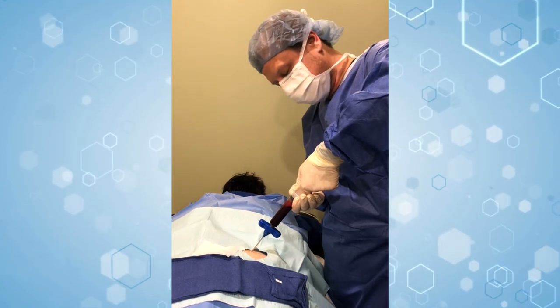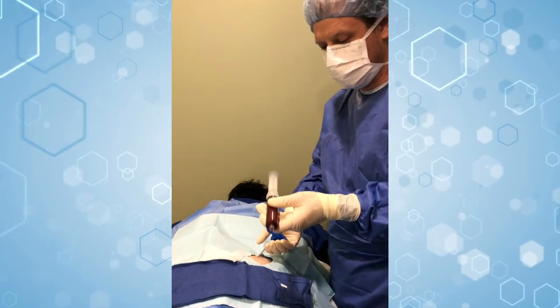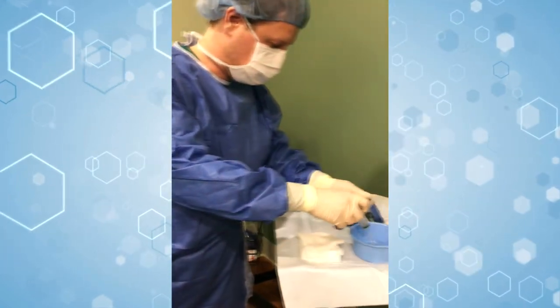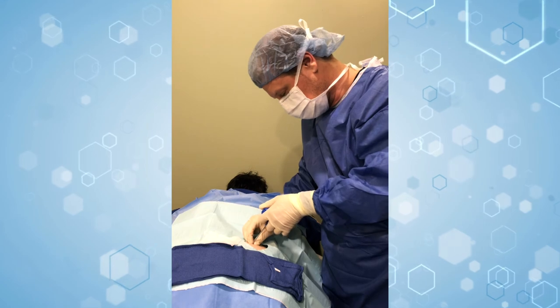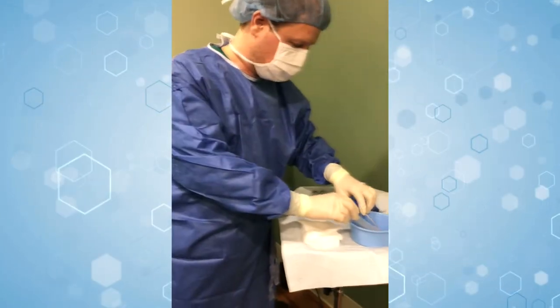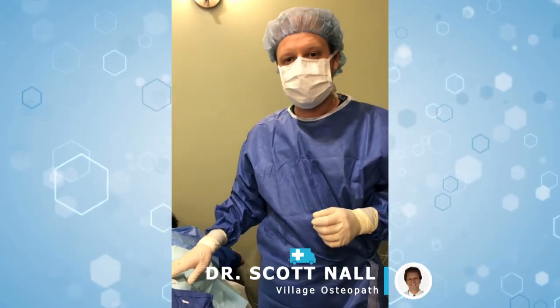Almost got this one done — about a third of the way done now. So now we're going to disconnect, put the stylet back in the trocar, lock it in, and then just gently pull it out. There's that one done. We'll set it over onto the field to use for later. As you can see, we still have two more to go, but very simple, relatively pain-free, and not anything like you would expect. So I hope you enjoyed watching and thanks a lot.